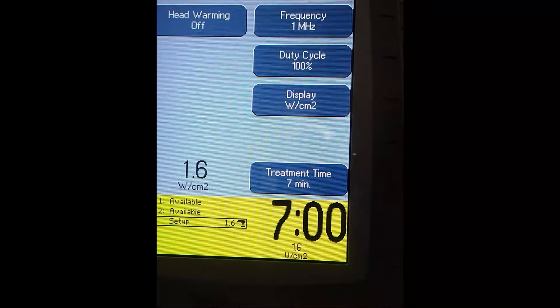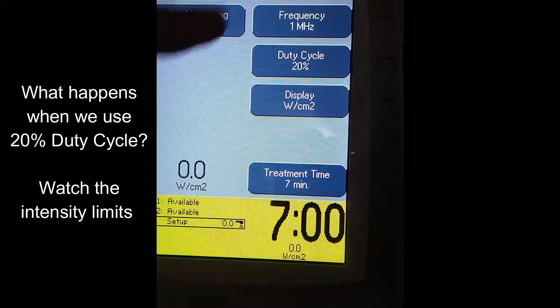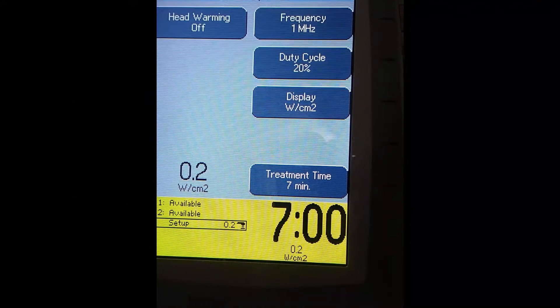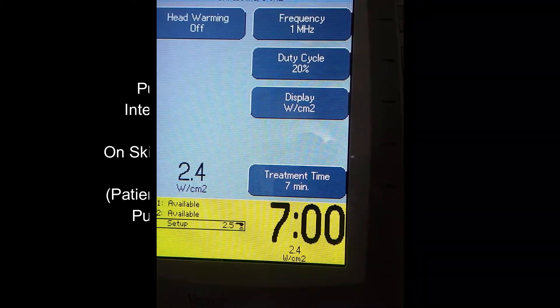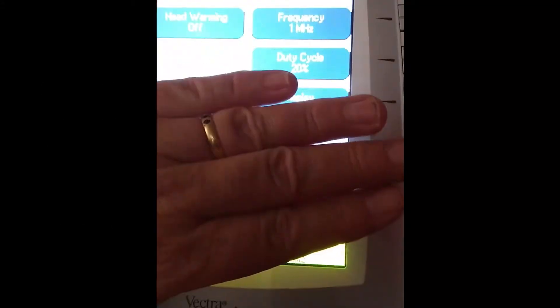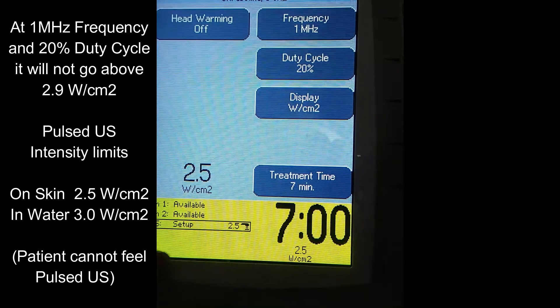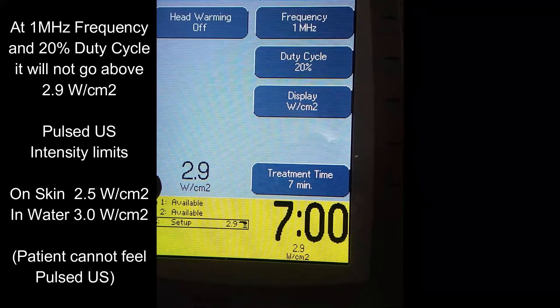Now watch what happens when we do 20% duty cycle. Let's see how high the intensity can go at 1 MHz. Turning the dial up — our recommendation is that you go to 2.5 and no higher when doing pulsed ultrasound at 20% duty cycle on the skin. When we get underwater, we're separated by about a quarter inch or so. Let's see how high the intensity goes on this machine — it goes to exactly where we want, which is 2.9 watts per centimeter squared.